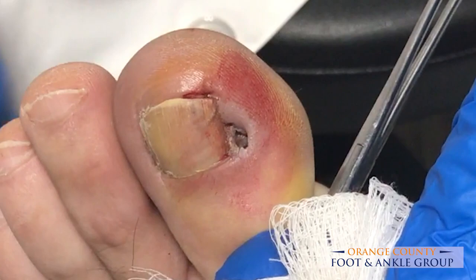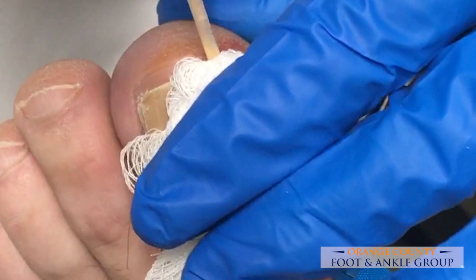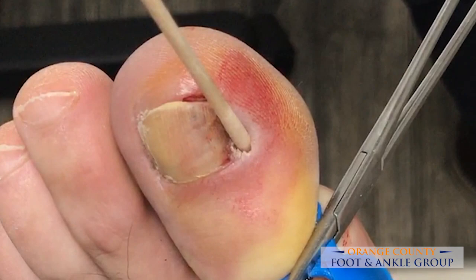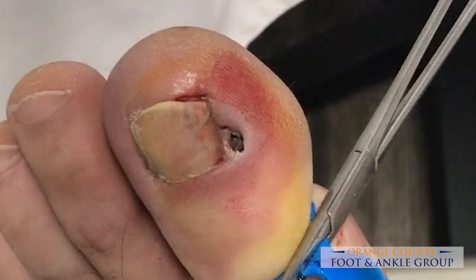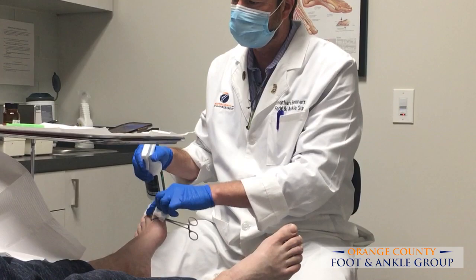We're just finishing up our second application of the phenol here, and we'll go ahead to application number three. We'll just let that sit for a second. Then I like to flush it with a little saline, a wound cleanser, or rubbing alcohol — anything to really get in there and flush out all the phenol so you stop the chemical burn.